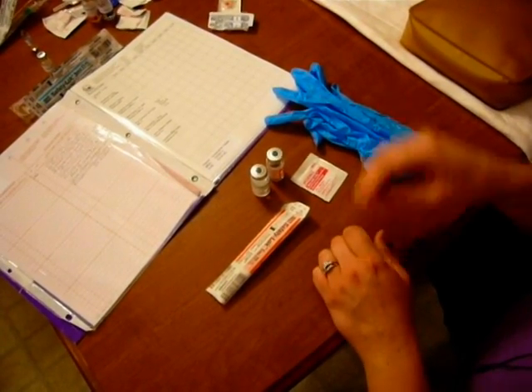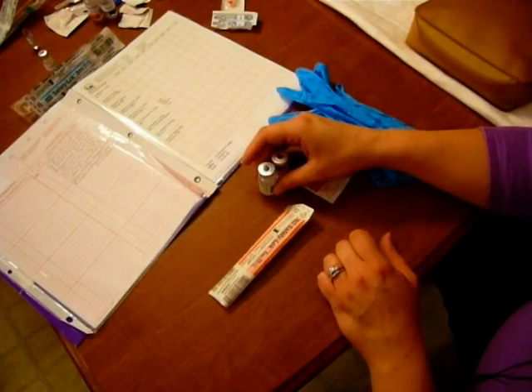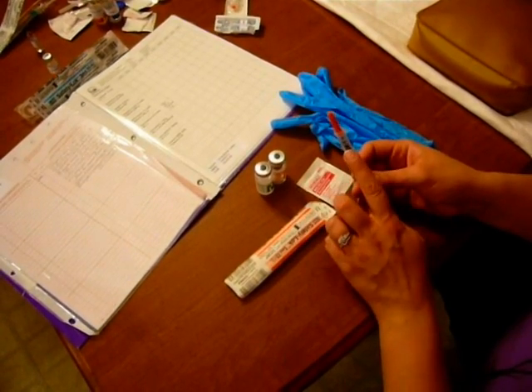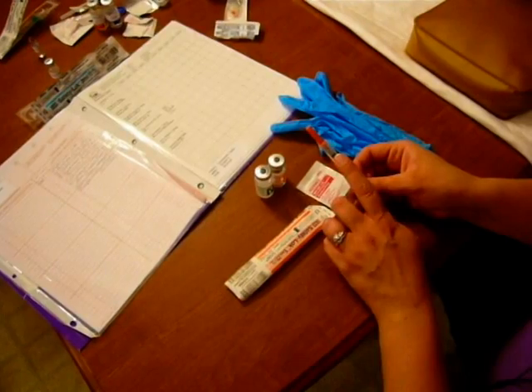Subcutaneous injections. One of the medications that we can give subcutaneously is insulin, and you saw that being drawn up in one of the other videos. Once we have the medication drawn up out of the vial of insulin, the last thing we're going to do is double check our dose one last time before we transition to giving it to our patient.